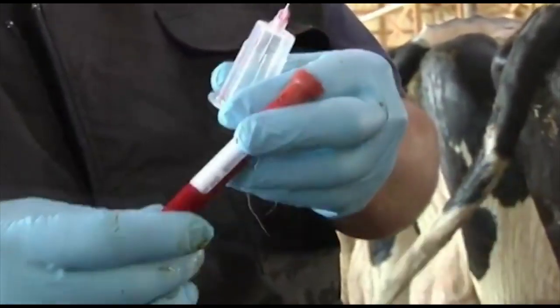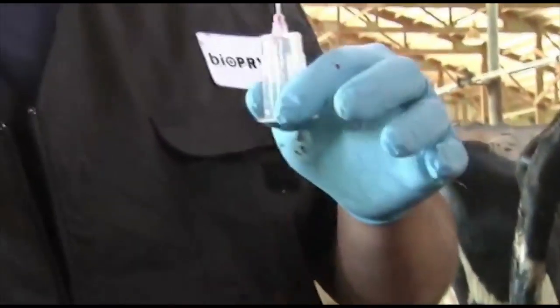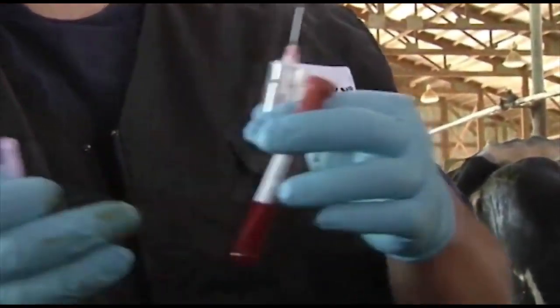Then mark it with the tube number and animal ID, and then switch the needle out for a new cow.